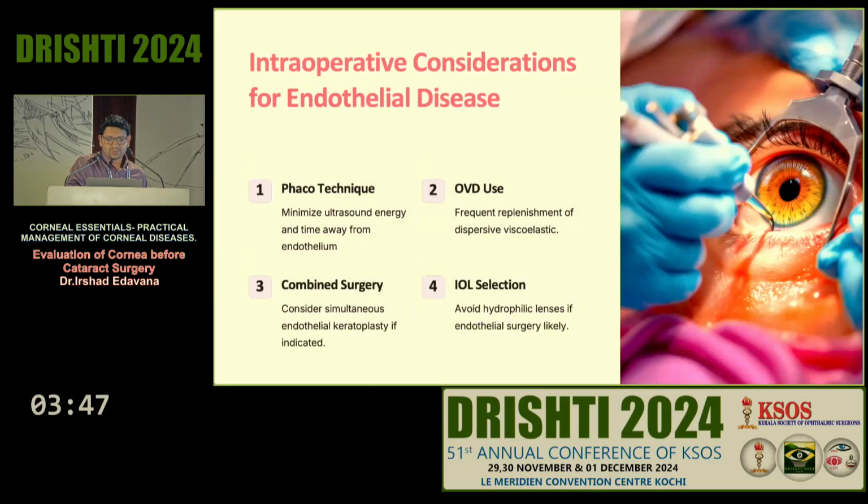So during the surgery, the phaco technique should be done to minimize the ultrasound energy, minimize the time, and keep the phaco pieces away from the endothelium. Use adequate viscoelastic, use dispersive viscoelastic, and replenish the AC whenever it's required.